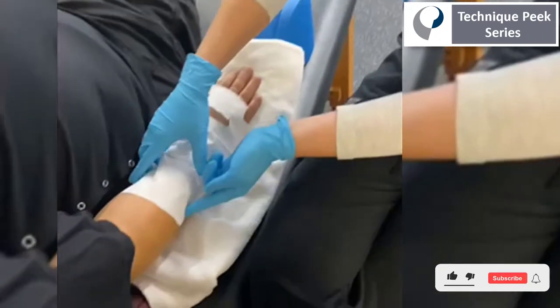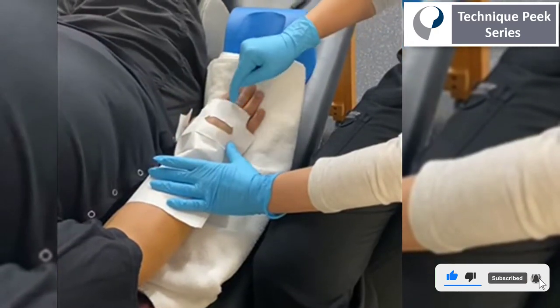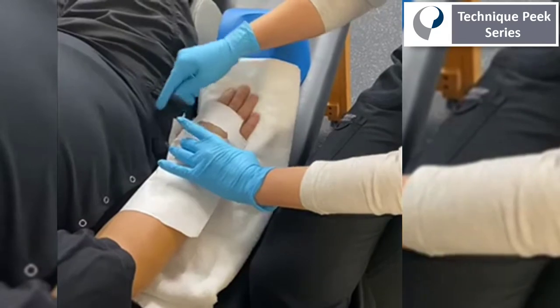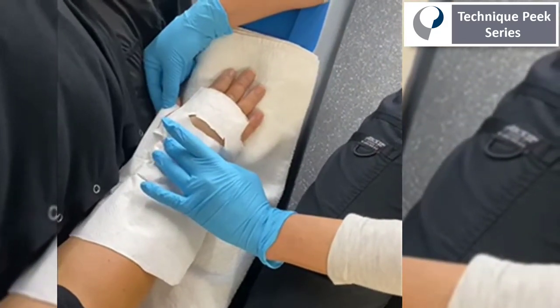We start with a piece of material that's going to be two-thirds the length of the forearm, going up to the dorsal PIP joints of all the digits, with a cutout for the MCP joints to allow for active flexion, and the thumb similarly up to the IP joint.